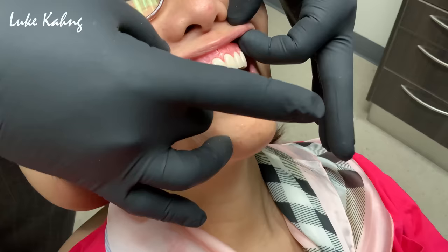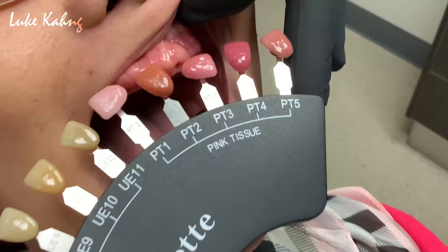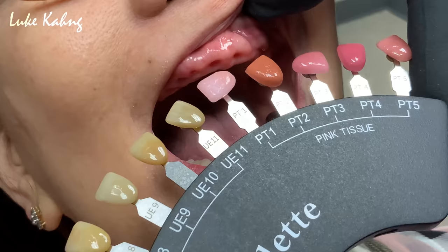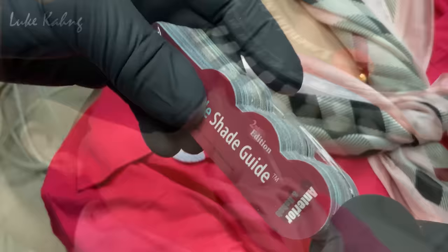And the other thing that I'm going to do that's very important to me, Luke, where's the shade guide? Sure. Right there. So what we'll do is I always take photographs of the shade of the gum, okay? And this is really important because this is what's gonna make this denture look very natural. Without this, you're gonna get a denture like you can get a cheap denture anywhere else. This is why I come to Luke, okay? Nice.